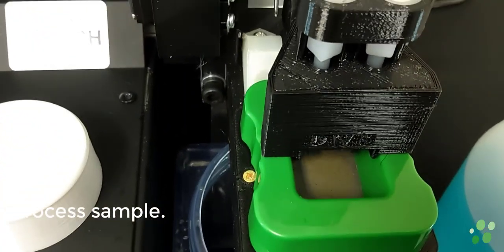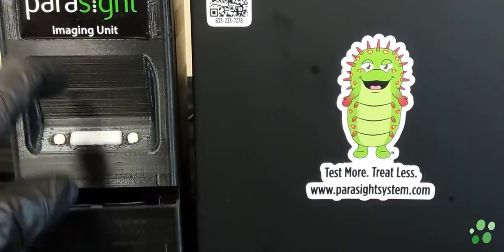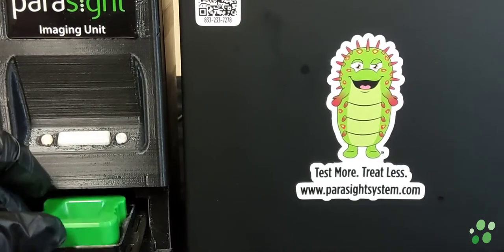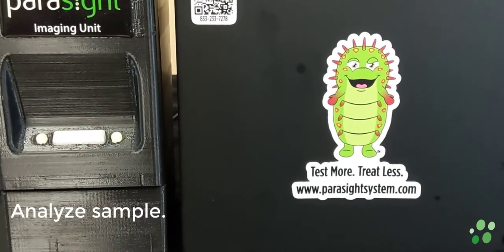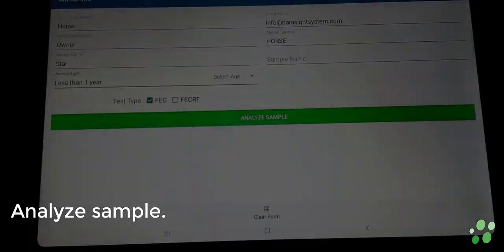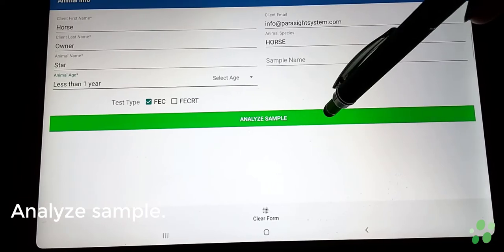When the process is complete, remove the egg chamber and insert it into the imaging unit. You are now ready for analysis. From the Parasight System app, enter the client information and tap Analyze.